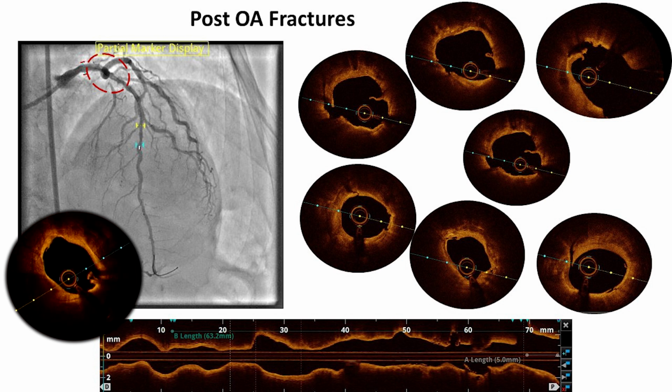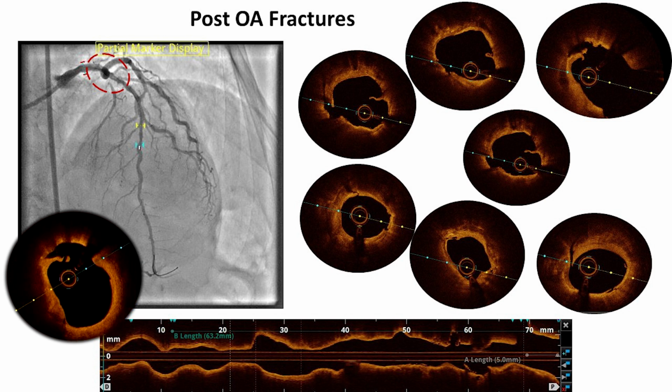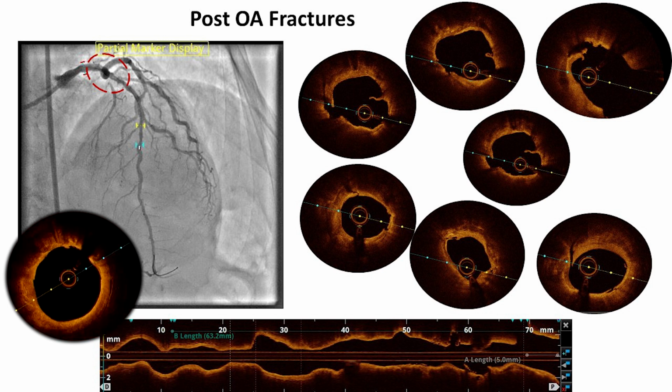There is a gain in the main lumen area exactly where the calcific segment is, because after orbital atherectomy, our intention is to see how the calcium is modified. So whenever you use imaging, use it optimally. What are you doing it for? Once you do the plaque modification, is it adequately modified or not?